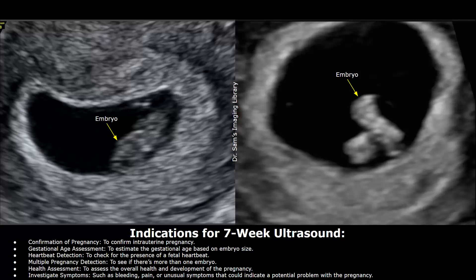If the patient is having symptoms such as bleeding, pain, or unusual symptoms that could indicate a potential problem with the pregnancy, an ultrasound can be performed.